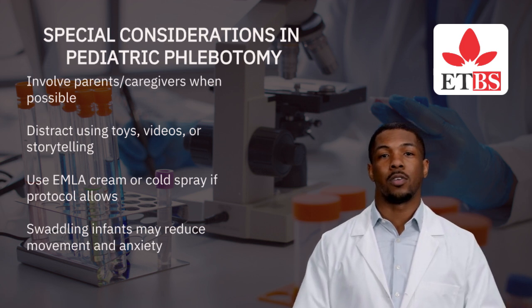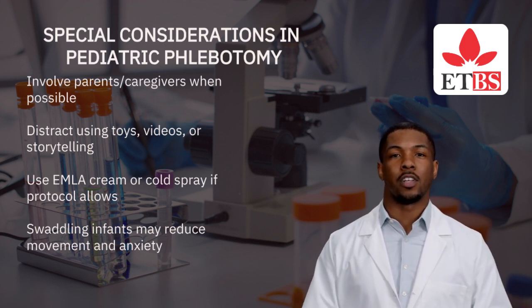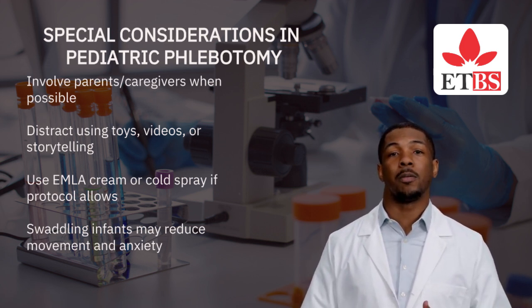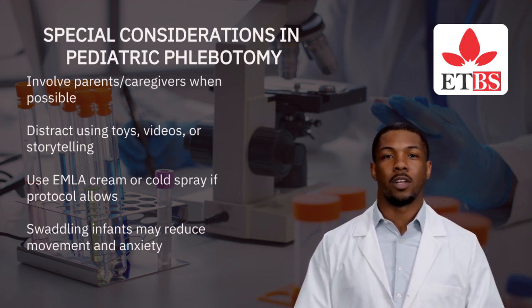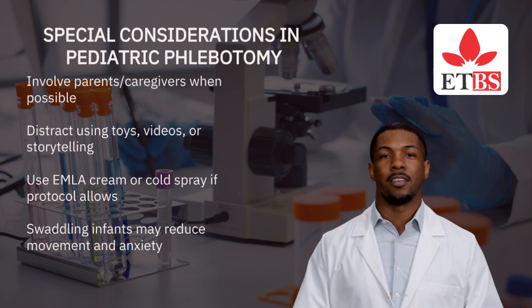Do not use excessive force. Do not restrain aggressively. Do not attempt repeated failed punctures without escalation. Do not promise it won't hurt. Be honest and comforting.